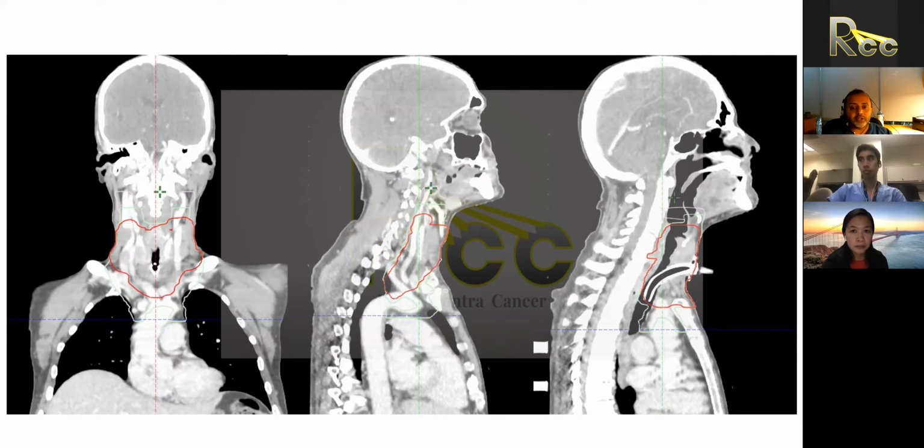I think that's certainly reasonable if you don't have VMAT. It always becomes a little hard when you're trying to put that match line right through tumor. So you can certainly do it. You can feather that match line over time. I have previously done exactly that, with a CT-based plan where we feathered the junction and did the inferior part APPA with some kind of fluence editing and the cranial part with intensity modulated radiotherapy.